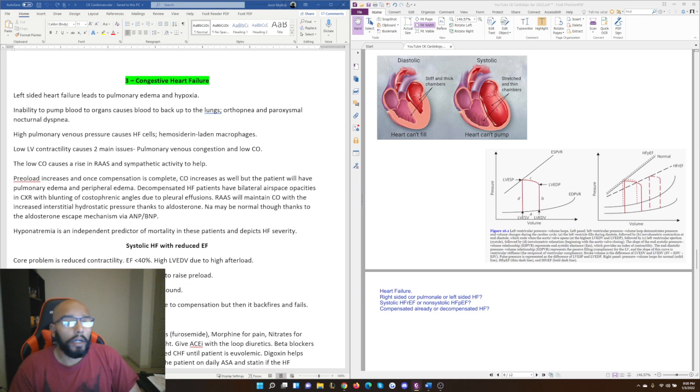All right. Another question you can see maybe something like a 58-year-old man comes to the physician. They might say he has a 5-day history of worsening shortness of breath and fatigue. Smoked a pack of cigarettes daily for 30 years, so that's pretty bad. Vitals are looking pretty normal. X-rays are then shown, and that's where it gives it away. When you look at the X-ray, you're seeing somewhat of a butterfly pattern of just a lot of congestion.